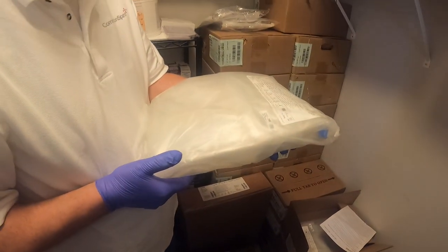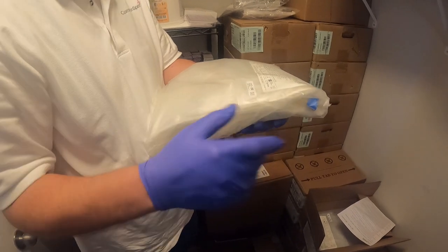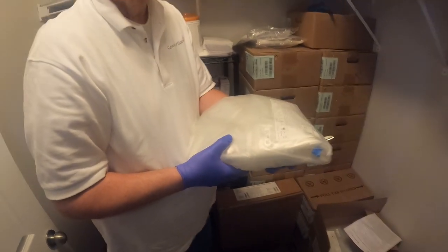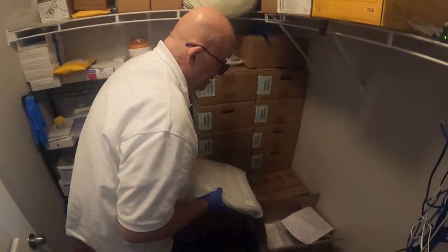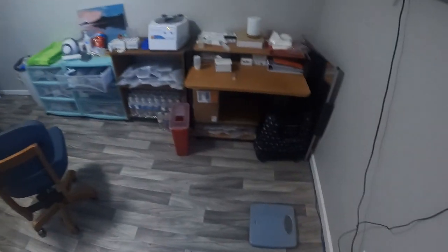As one of these. And then every other day, I have to come in here and load that in that drawer. It takes 7 hours for that machine to make that tub full of dialysate out of this. We do that every other day. Gotta be attentive. And you always have your safety buckets.